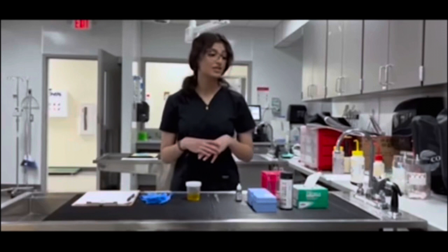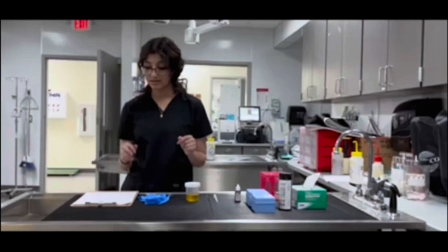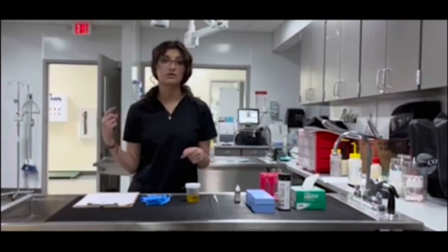First things first, you want to make sure you have all of your equipment out and ready to be used. Then you want to make sure you have your urine sample as well as your urinalysis record sheet. On the urinalysis record sheet, you're going to write the patient name, the collection method, the date, time of collection, and your initials. That way, the urine samples don't get mixed up as you're walking through the clinic.